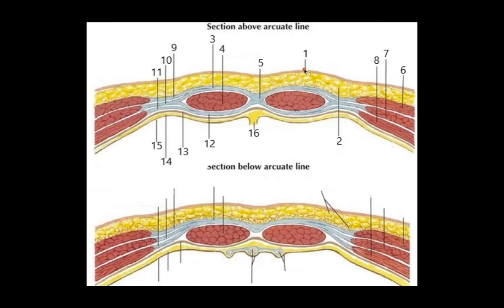The parts you would be seeing with the trocar: the skin is cut with a scalpel, so you don't see that. You first see the trocar in the subcutaneous space, then it progresses through the anterior rectus sheath, which is white in the body just like in the illustration. Then you go into the red or pink muscle, then you hit the posterior rectus sheath. The transversalis fascia is usually not seen too distinctly in real life, so you'll pass through it without noticing. Then there's a layer of preperitoneal fat, and finally the peritoneum — the last layer before you're in the abdominal cavity. You don't always see all of these layers when actually going through, so keep this in mind as we take another look at the video.